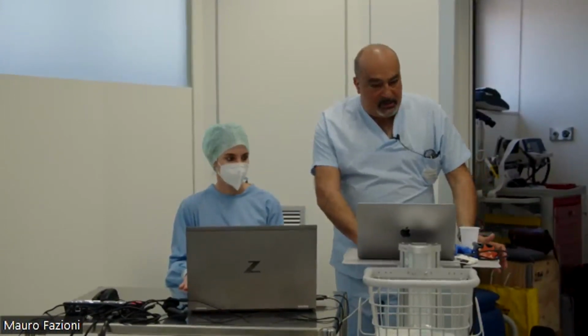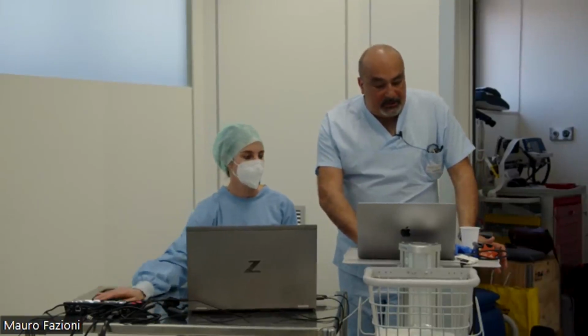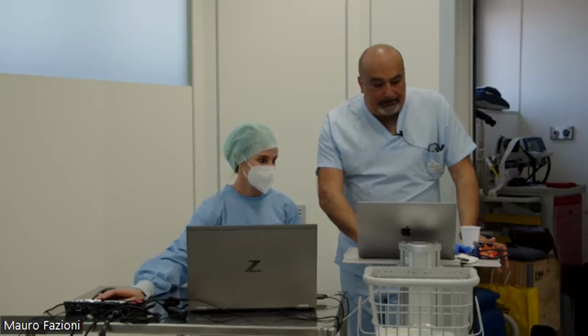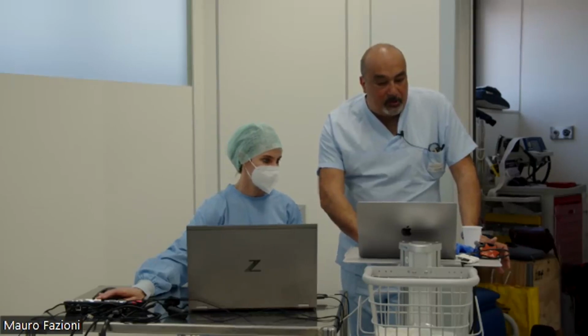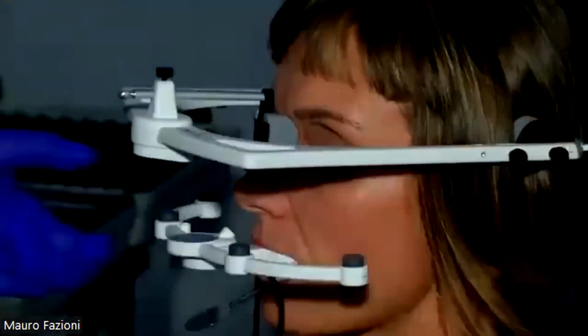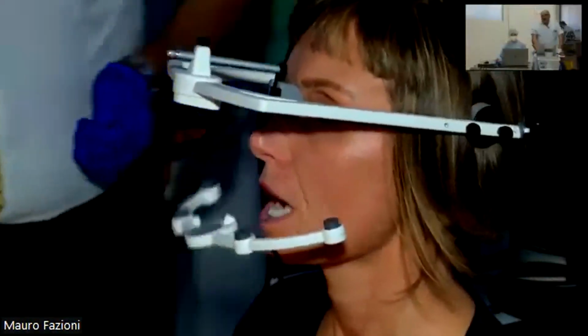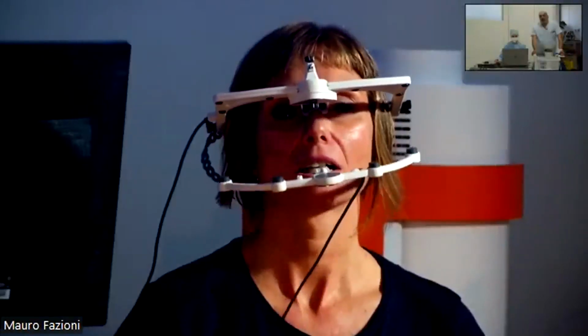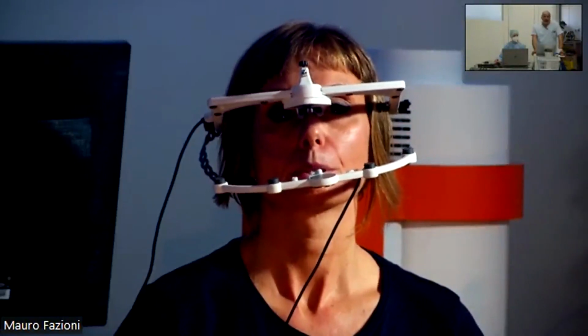Here you can see we collect the movement with an axiography, we collect all the patient movement once a month. This is our collection. We record all the movement and we use this recording, changing the morphology and the vertical dimension, as you see.